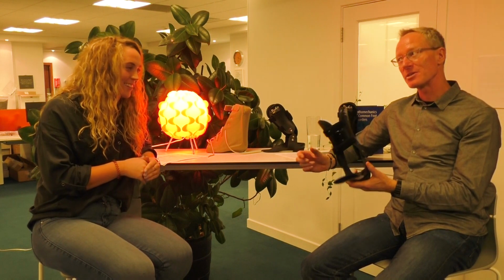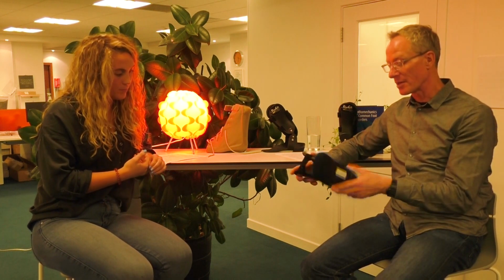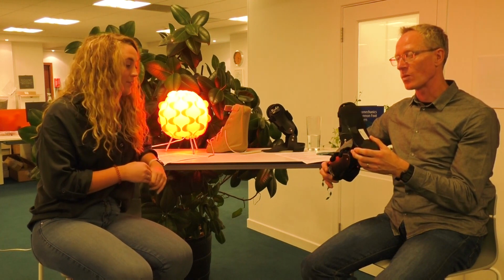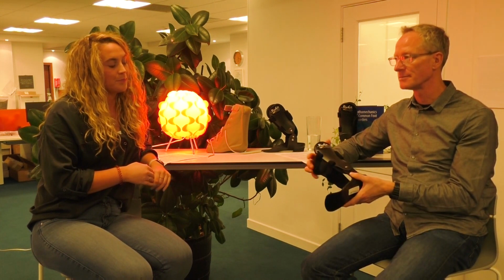Yeah, so 6 millimeters is quite significant, and that really creates a supination moment of force, or that's what we think it's doing. You know, the other thing with the adult acquired flat foot is definitely the heel lift. Oh yeah, definitely. Why in that case? Why do you think we would want to use a heel lift in that case? Anything in particular? Reference gastrosoleus?